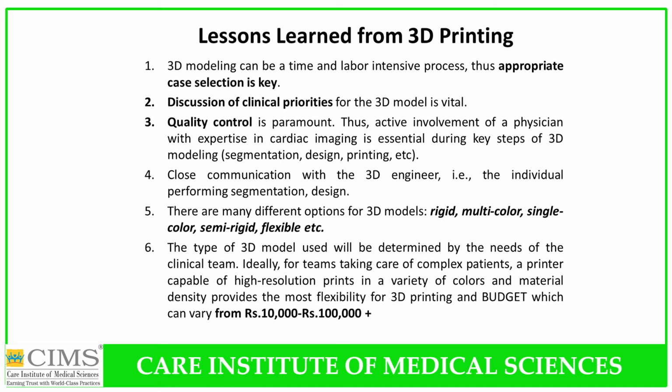There are many different options for 3D models such as rigid, multicolor, single color, semi-rigid, flexible. We used a semi-rigid, semi-flexible model because that was the only one available to us. Eventually the model used will be determined by the needs of the clinical team, ideally for teams taking care of complex patients, and the cost in India varies between 10,000 rupees to 100,000 rupees. Our model cost around 15,000 rupees, which was very acceptable.